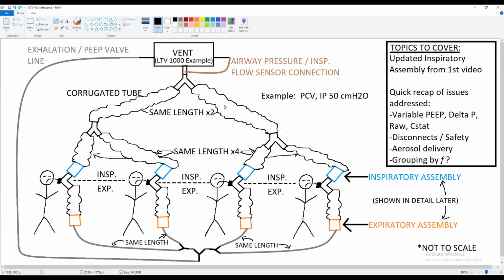Let's do plus 50. So it would be plus 50 in here, which means plus 50 in here. And this is on breath delivery, so whatever rate you want. To discuss breath timings and ventilation scheme and the potential tidal volumes that the vent can deliver in the previous video, we would have plus 50 in all of these.